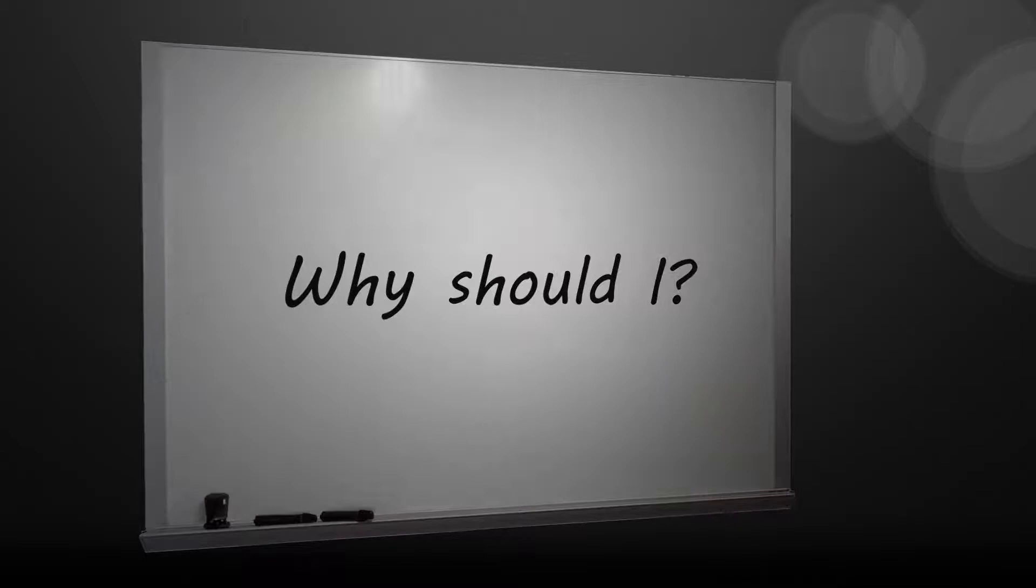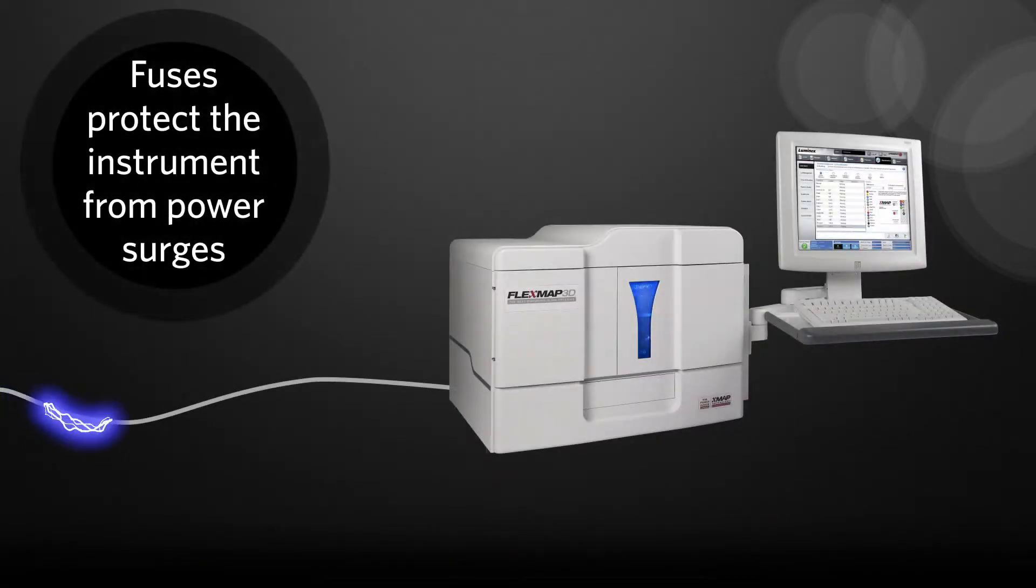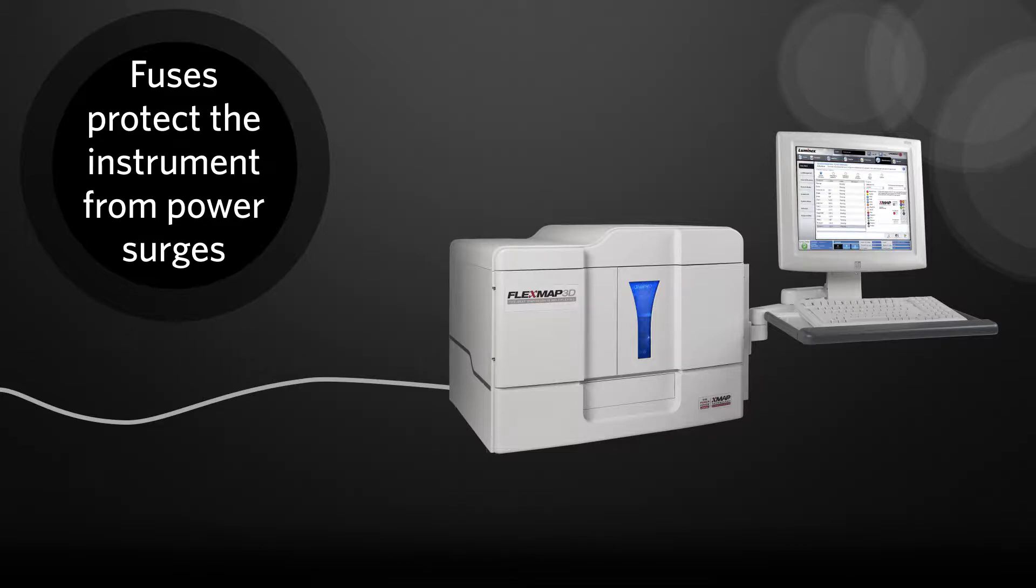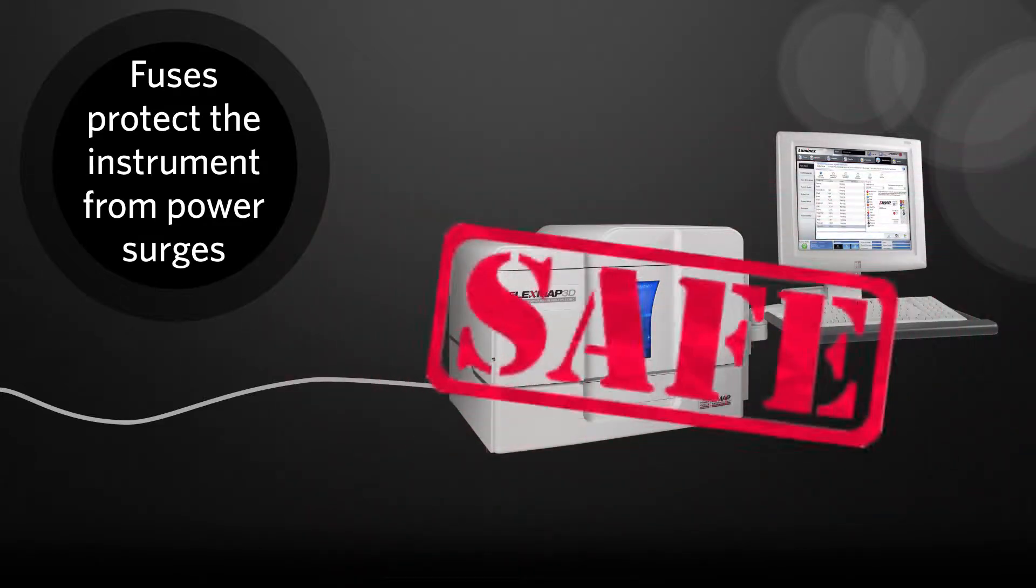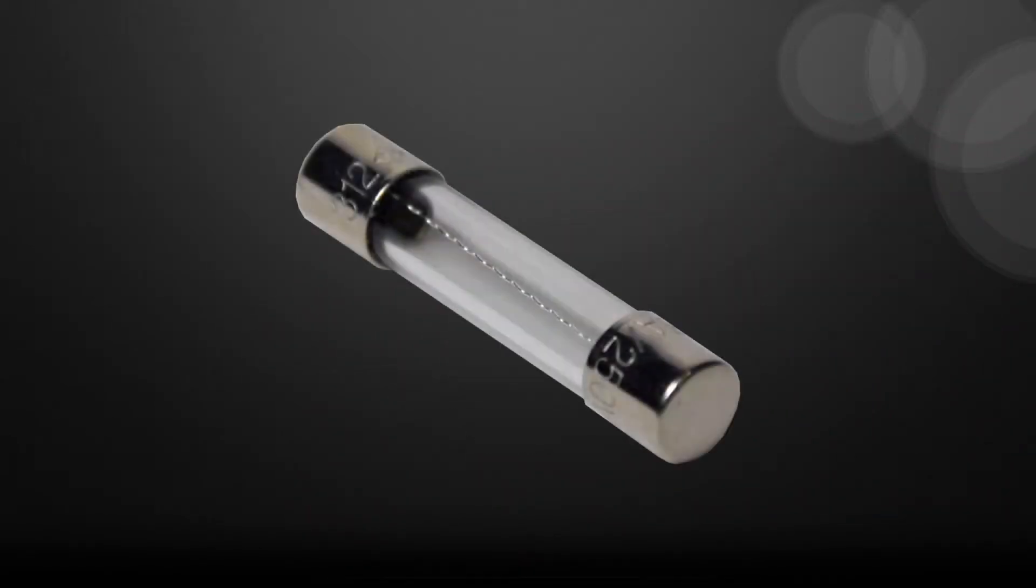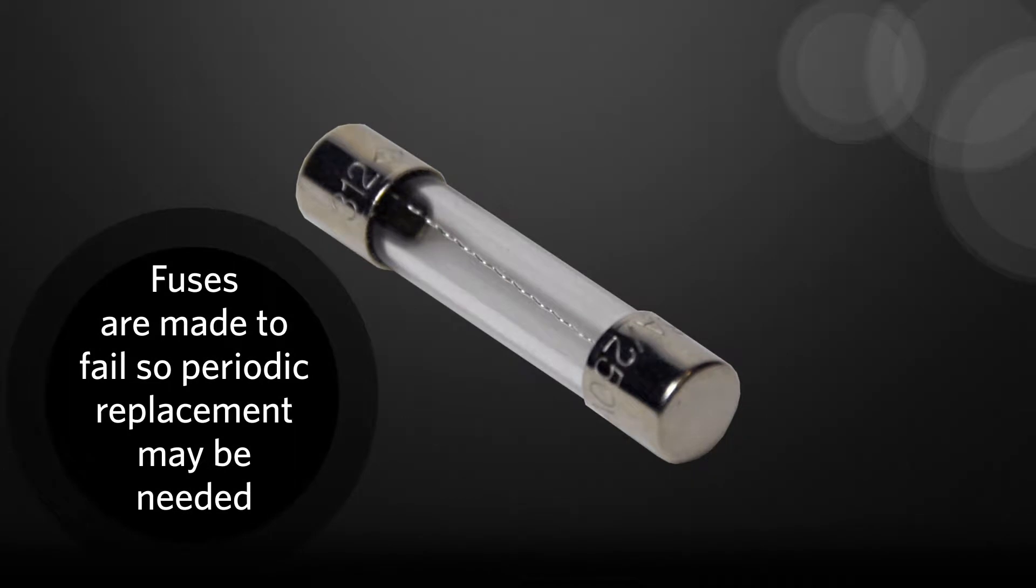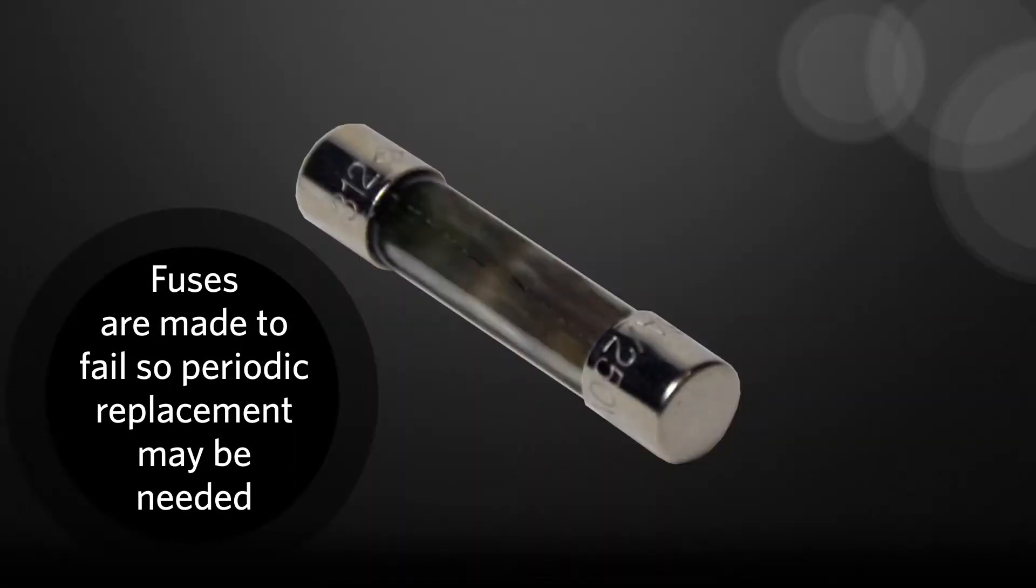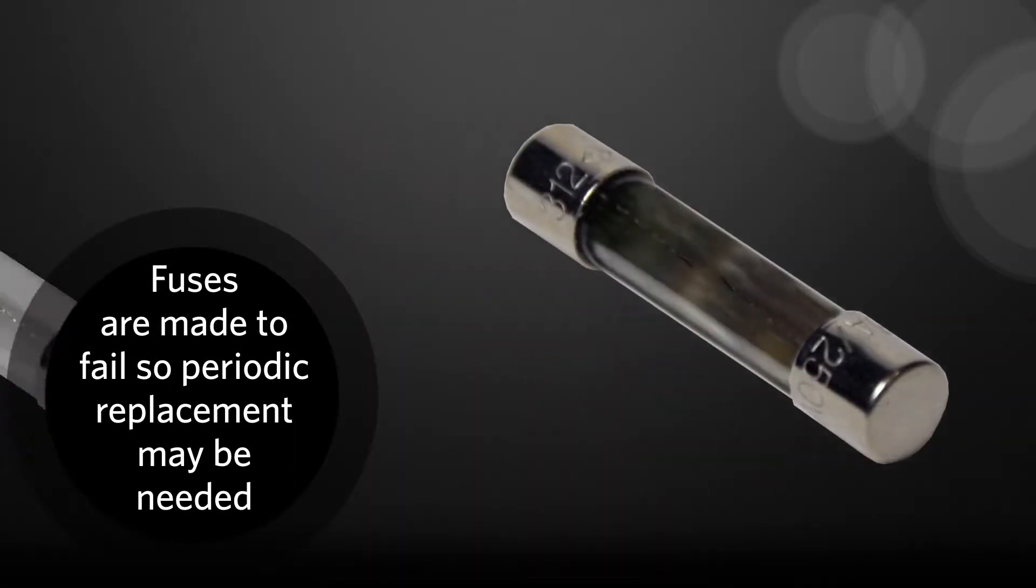Why should I replace the fuses? Fuses are in place to protect the instrument from power surges. This keeps the instrument from being damaged and or becoming dangerous to operators. These parts are intentionally made to fail, so periodic replacement may be necessary.